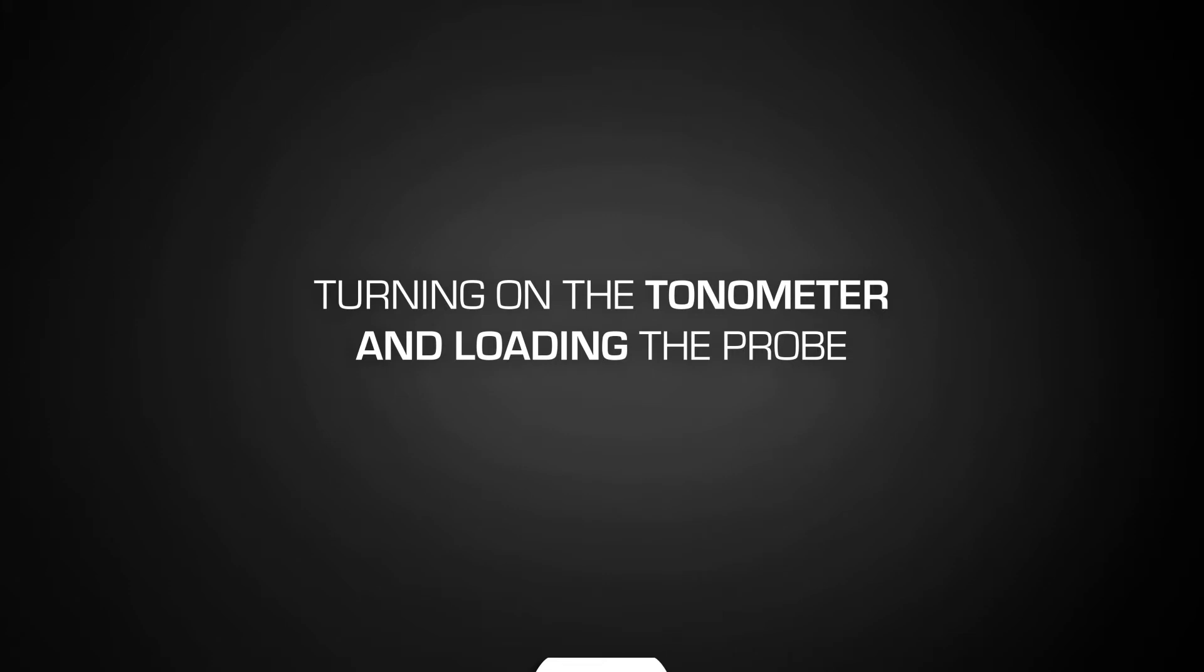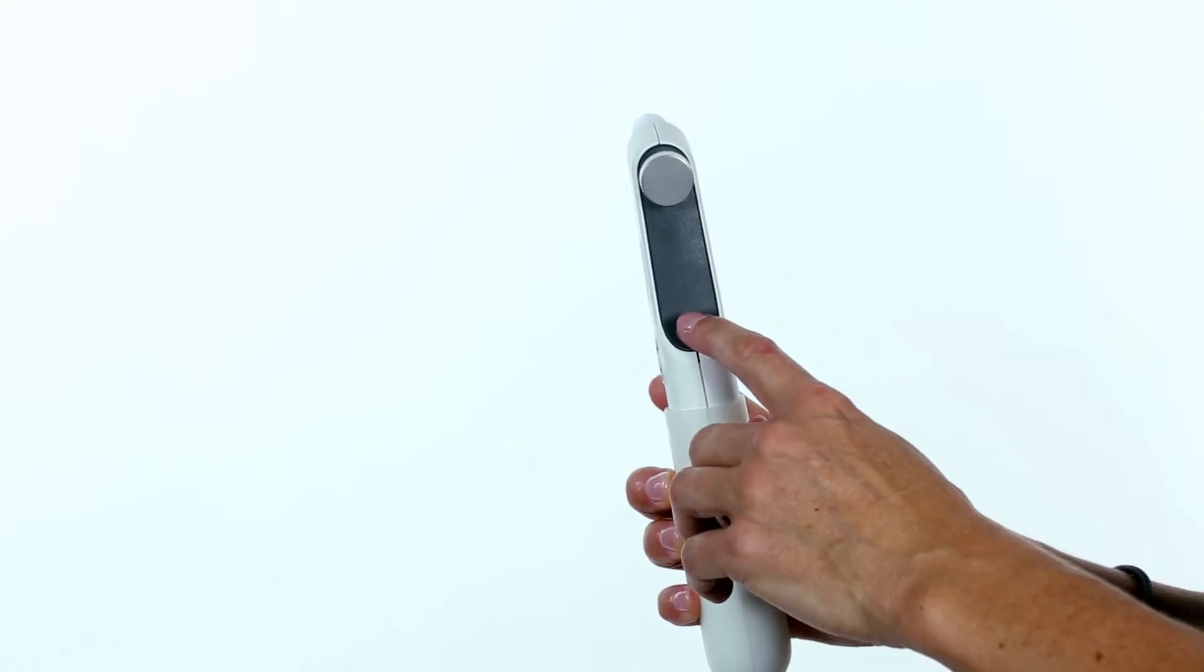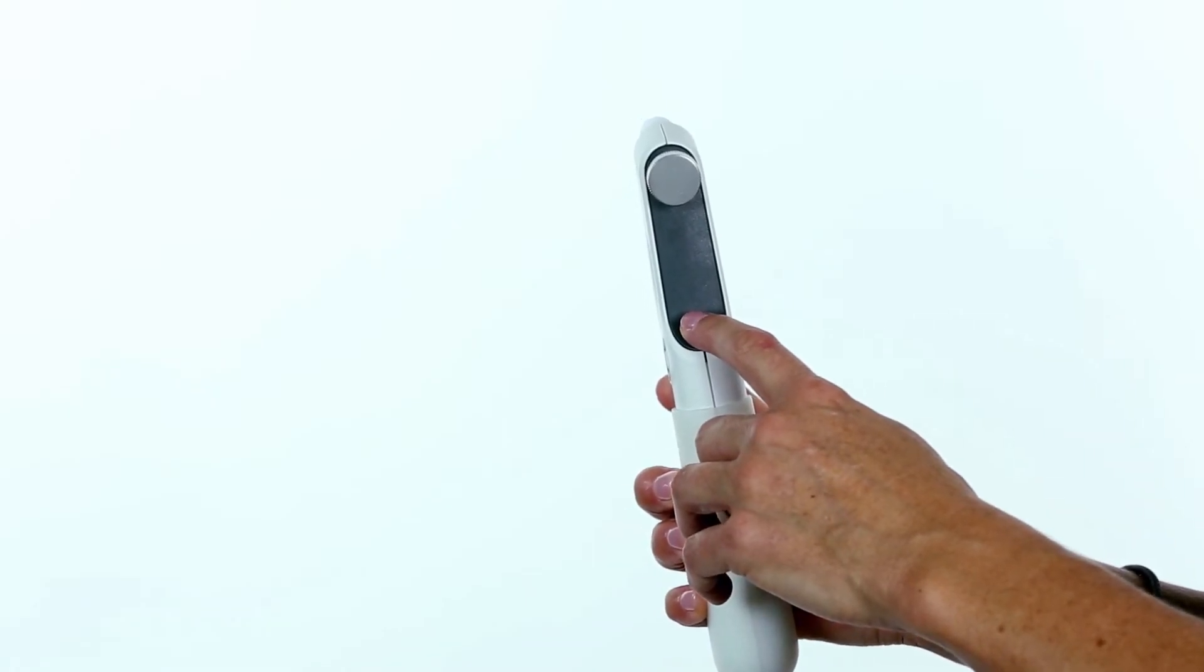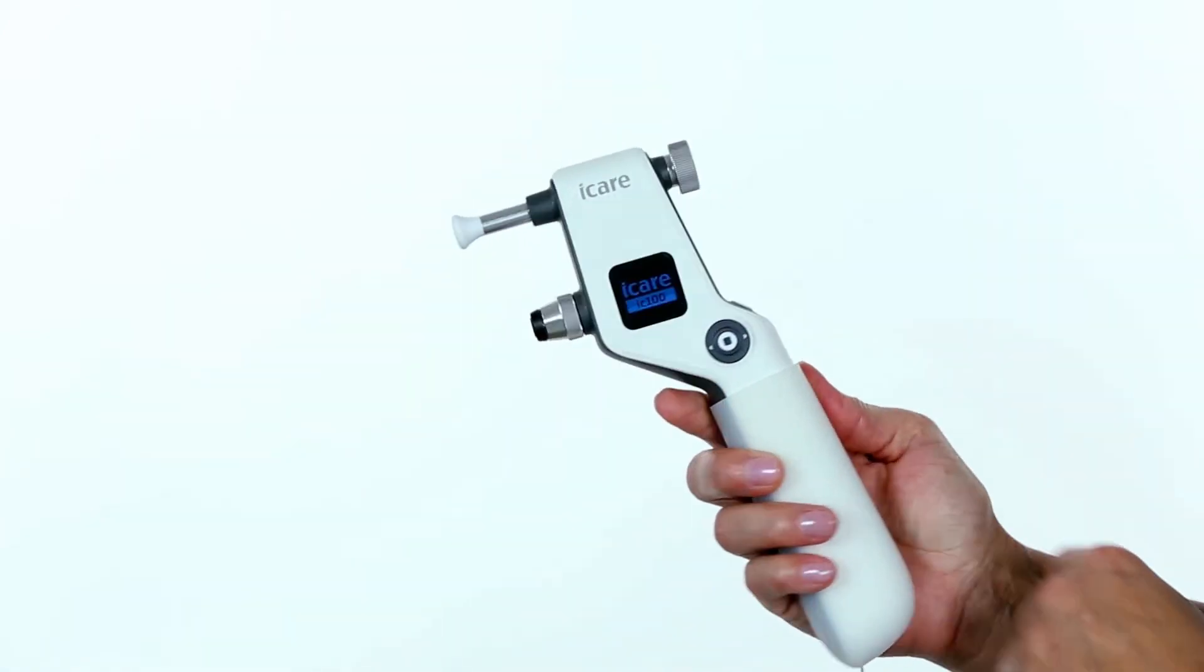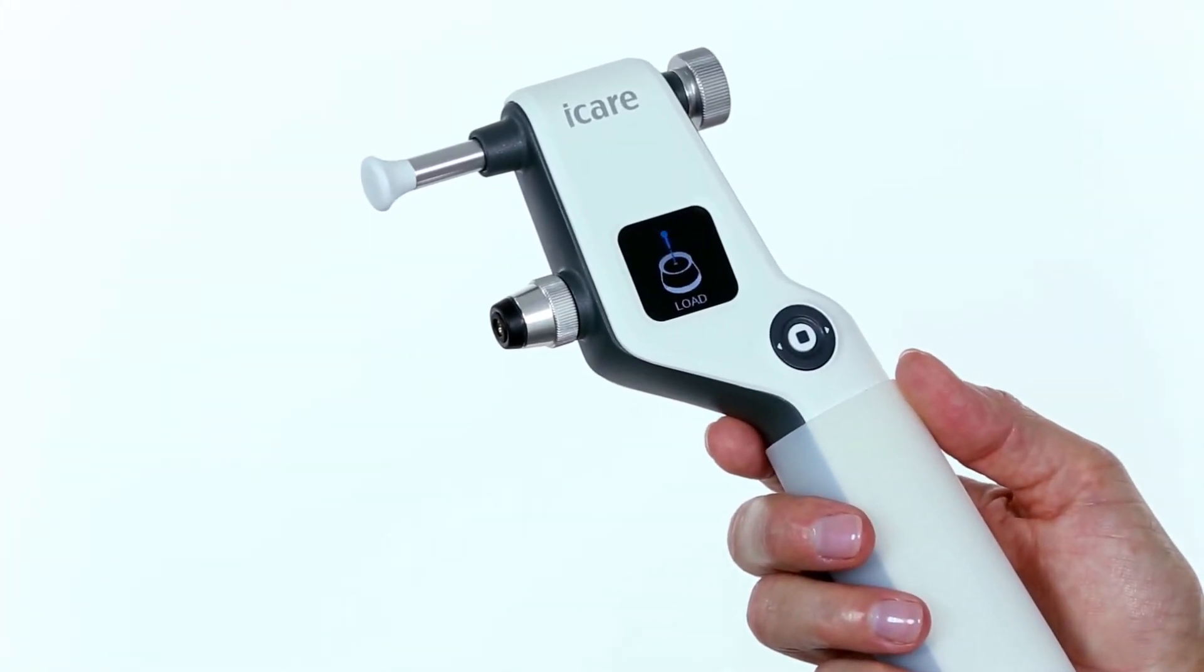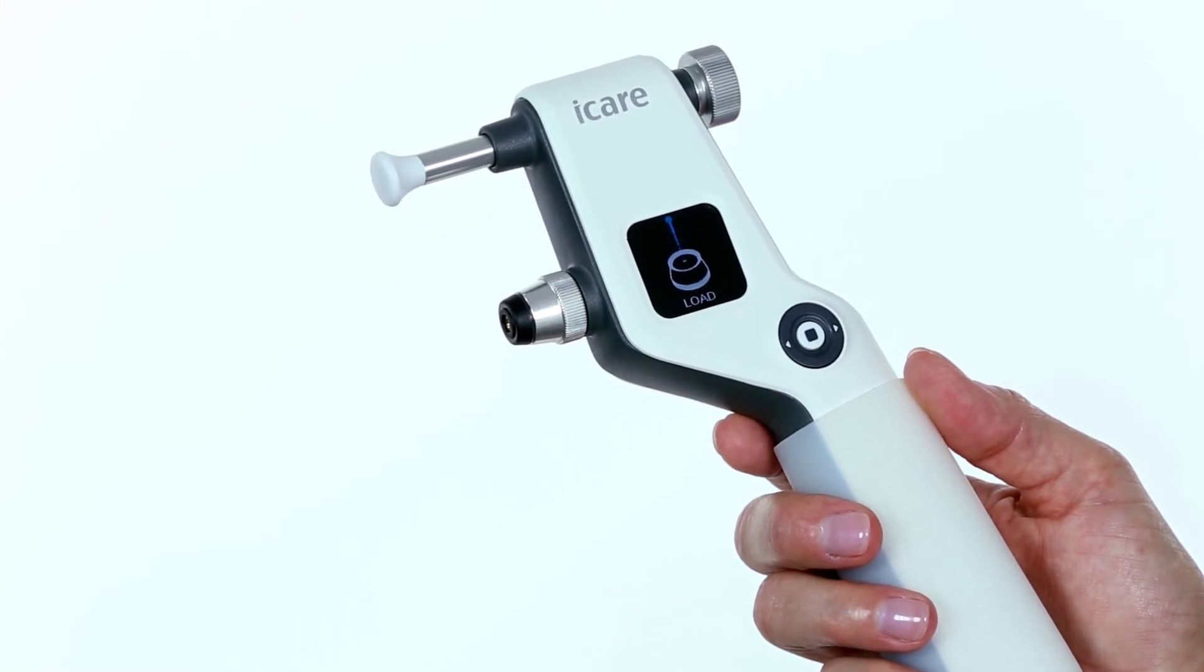Turning on the tonometer and loading the probe. To turn on the tonometer, press and hold the measure button for 3 seconds or until you hear a beep. Load the probe into the tonometer when the display screen shows Load Probe.